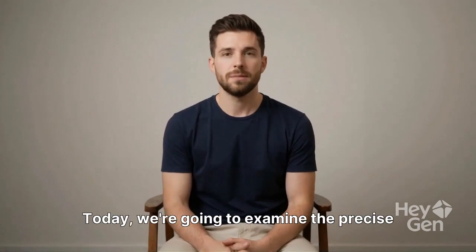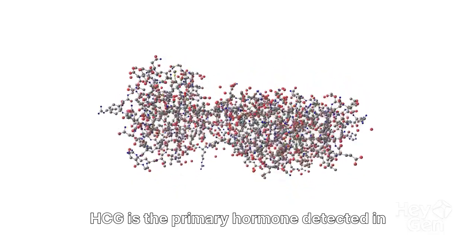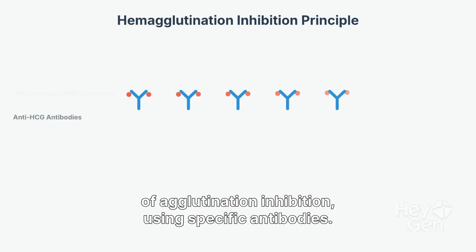Today, we're going to examine the precise procedure for the indirect HCG test. HCG is the primary hormone detected in early pregnancy, and its accurate measurement is critical. The indirect method works on the principle of agglutination inhibition using specific antibodies.